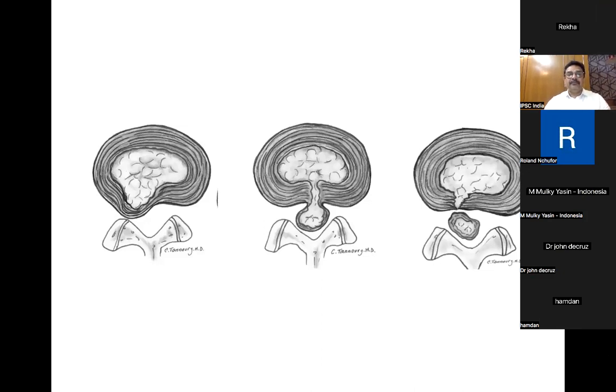Now look at this. Can you see this? What will you do in this case? Obviously, sir, this I can extrude through the inside-out technique. Wonderful. The first one, very good. The second one, I should go half in, half outside. We can do this.